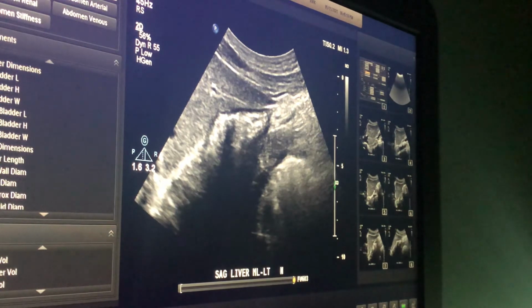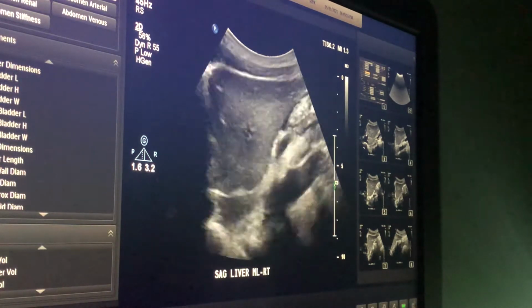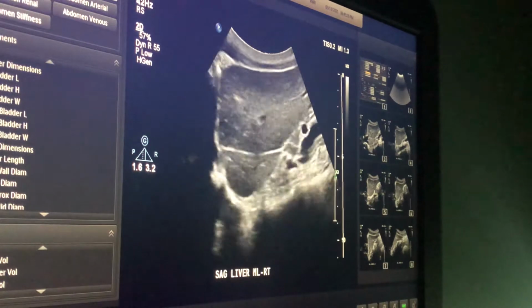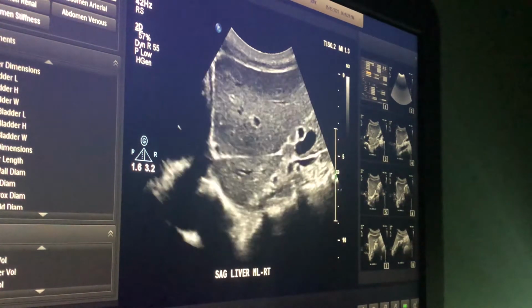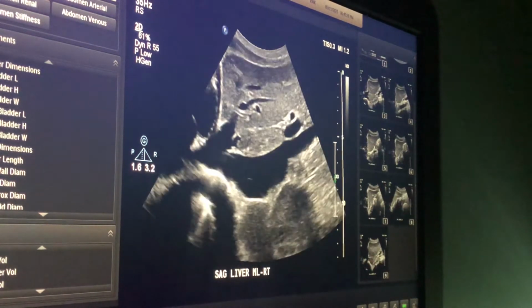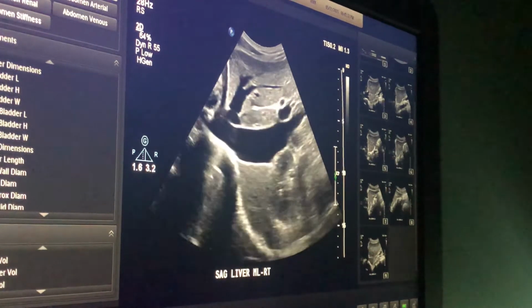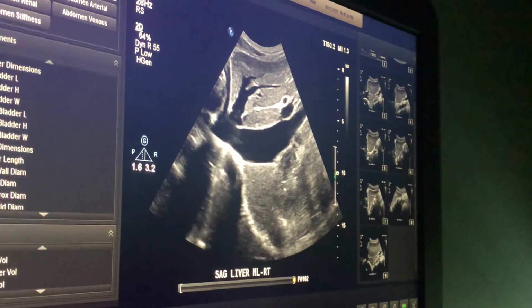Next, I'm going to look at the right lobe of the liver, sweeping from midline to right, starting at the same point of the caudate lobe. Deep breath in and hold when you're ready. So I'm going to start right about there. This time sweeping right. I am increasing my depth here to visualize the tissue posterior to the IVC. Breathe, patient.